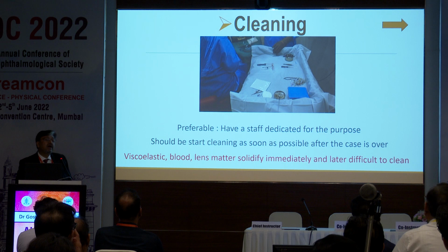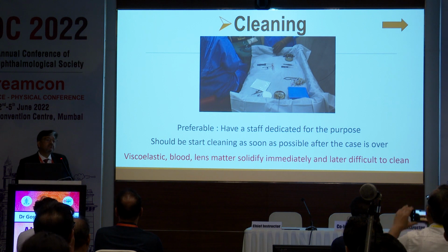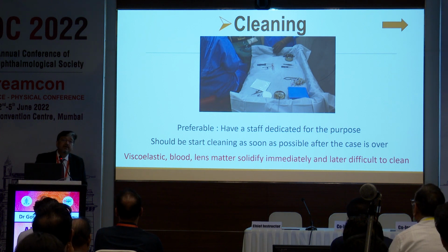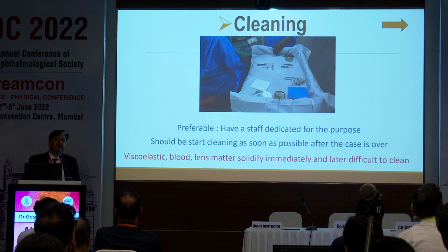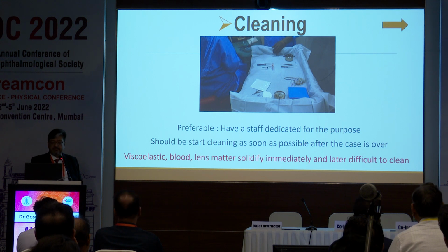One thing is to have a dedicated staff, especially in a high volume OT. You should have a dedicated staff who continuously take away the instruments from the used set, take them to the cleaning area and start cleaning them immediately, so that whatever material has got dried up gets cleaned up as early as possible, and the instrument life increases and the safety of the patient in the long run increases.